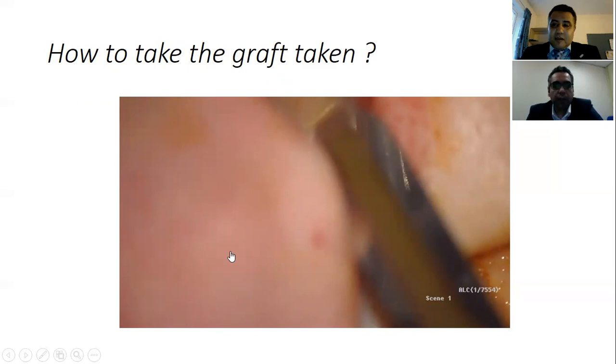Is there an instrument that makes elevation of the tympanomeatal flap easier and avoids expected bleeding? As mentioned, pledgets and hypotensive technique are key. If the field is bloody, use pledgets with 1:100,000 adrenaline and ask the anesthetist to control blood pressure — the communication between you and the anesthetist is very important.